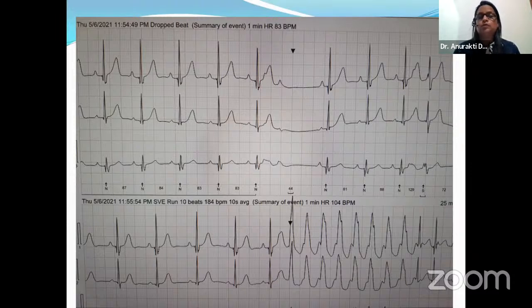So I'm just giving you examples and we can discuss at the end what was what. But this is also a patient who gives you a history of palpitations. You put AECG and this is what it comes up with. What do you think it is? And if you want me to play it again at the end of the session, we can do that as well. So palpitations becomes one of the second best indications to do a Holter monitoring.